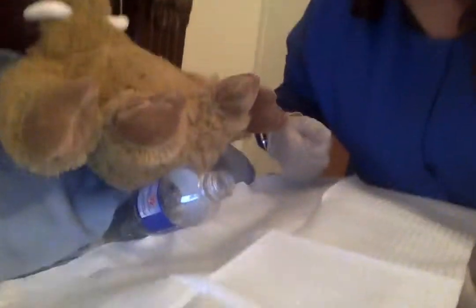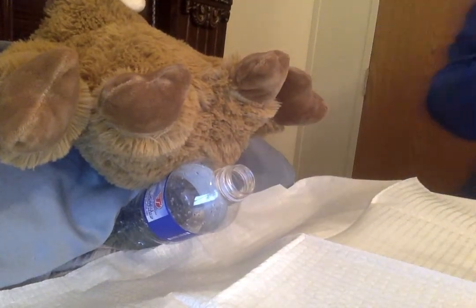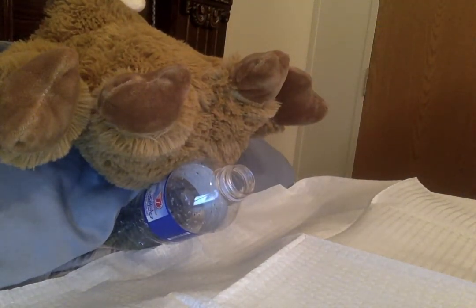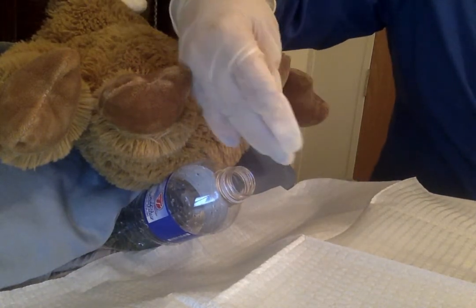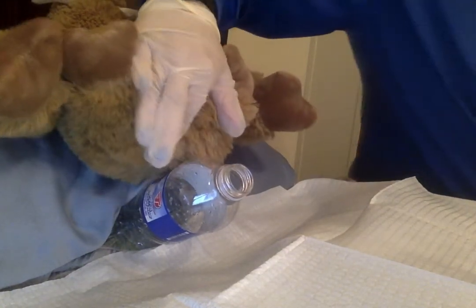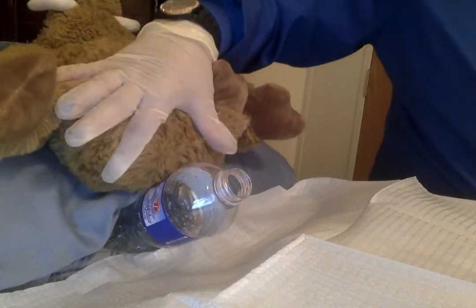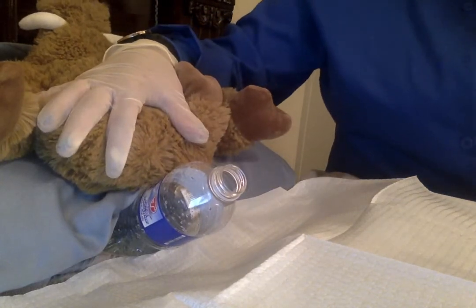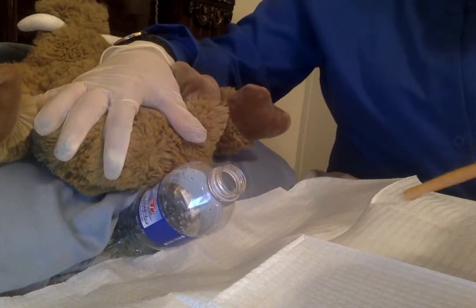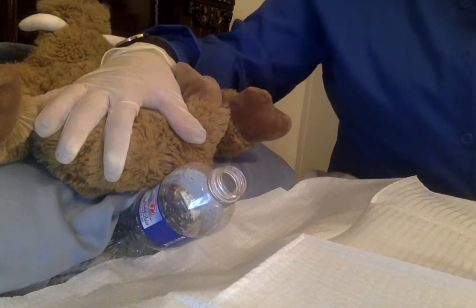I'm going to move the camera to get a close-up. Okay, so what we're going to do is we are going to place our hand and we're going to spread open the labia to get a better look at where we're going. We're going to put lube on the end of our catheter. So putting lube on.